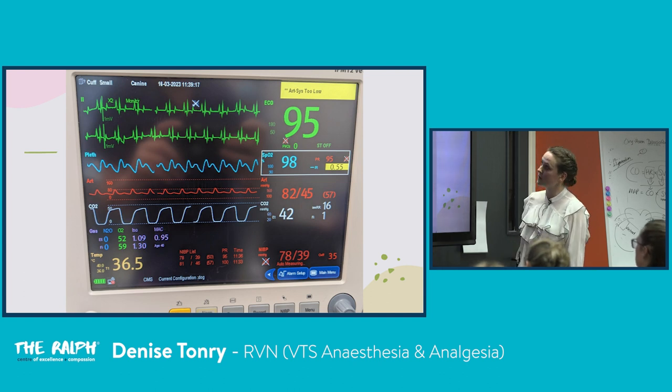This one, for example, I would say our heart rate is sufficient in this patient. And we still have our low blood pressure, our ISO level's not too high, so we will be thinking about something else. We wouldn't be thinking about directly increasing this heart rate. We will be thinking more of a vasopressor, whether that's a short acting one or a longer acting one, depending on the procedure and the patient that we're dealing with.